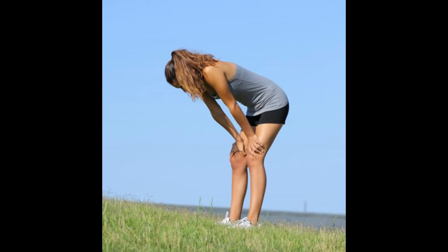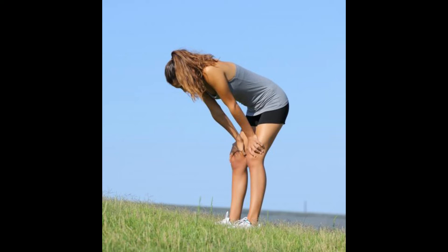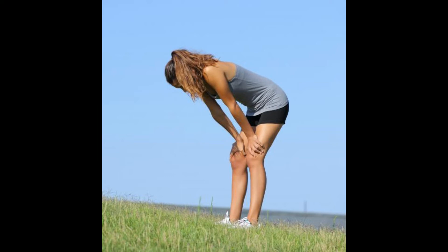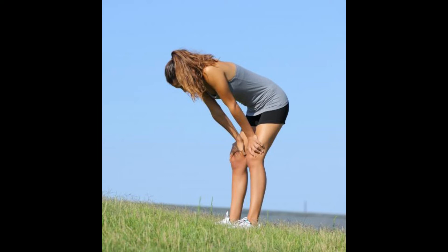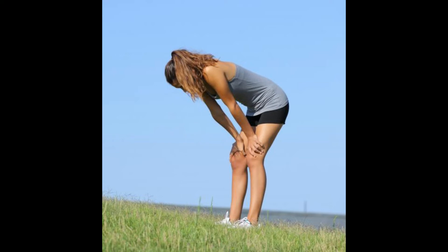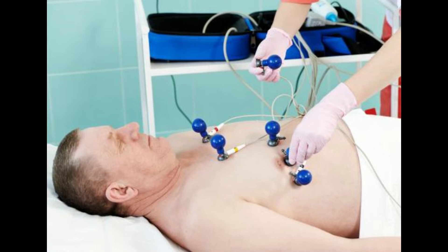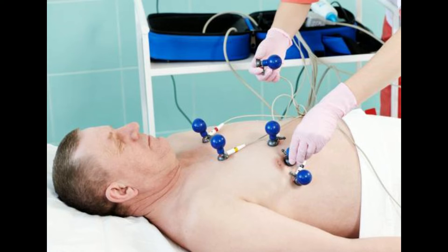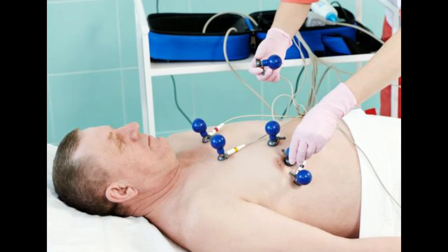In general, LAD is not in itself problematic unless it is deviated to a large extent or unless it is accompanied by other cardiac problems. There are many different reasons why this sort of deviation can happen and not all of them are worrisome. This is particularly true if the deviation is minor and doesn't repeat. Deviations that look like small blips could be what is known as a normal variant — things that show up solely on an electrocardiogram without any other indications of heart disease. Some studies have shown that LADs occur in up to 14% of all ECGs that are otherwise normal and were taken of patients without known heart problems. Any axis deviation from the normal range, however, is usually classified as an ECG abnormality, and further clinical testing is generally recommended in order to rule out something more problematic.